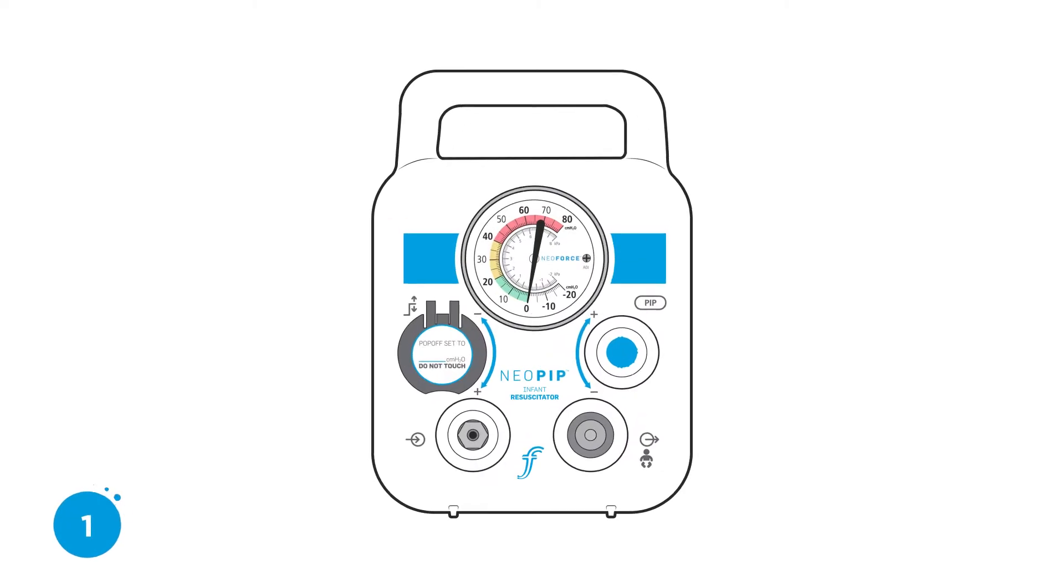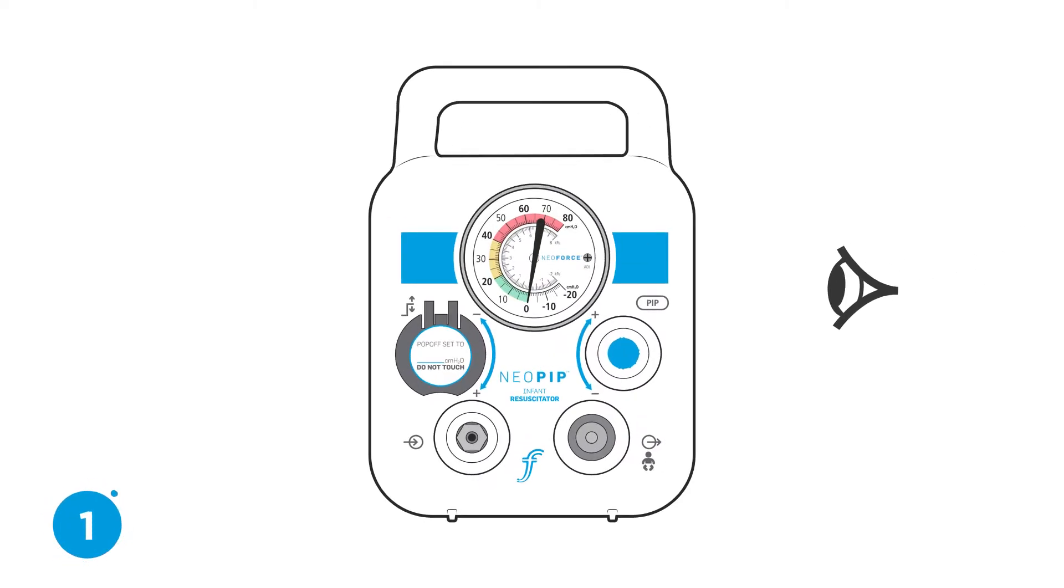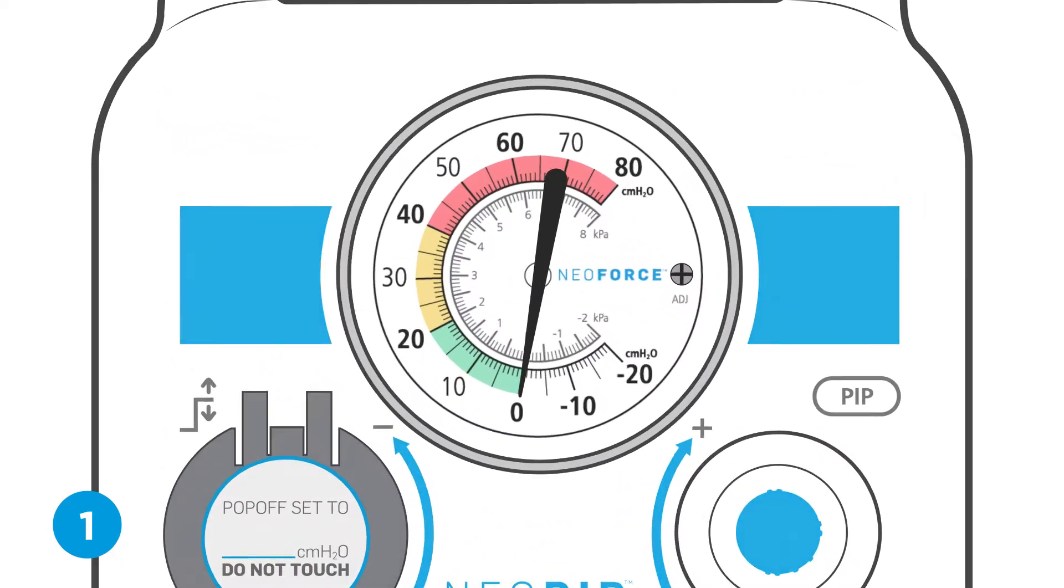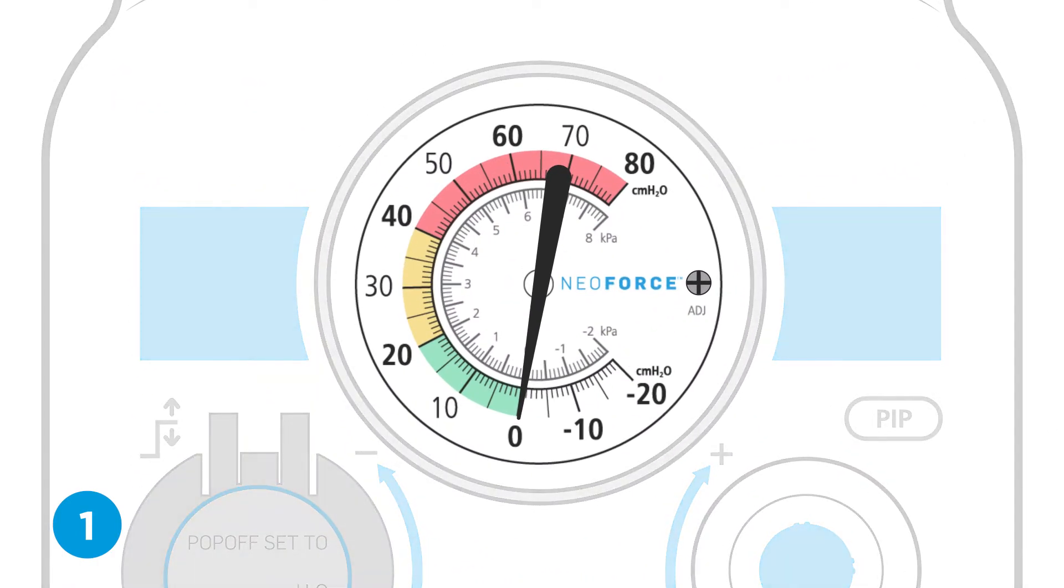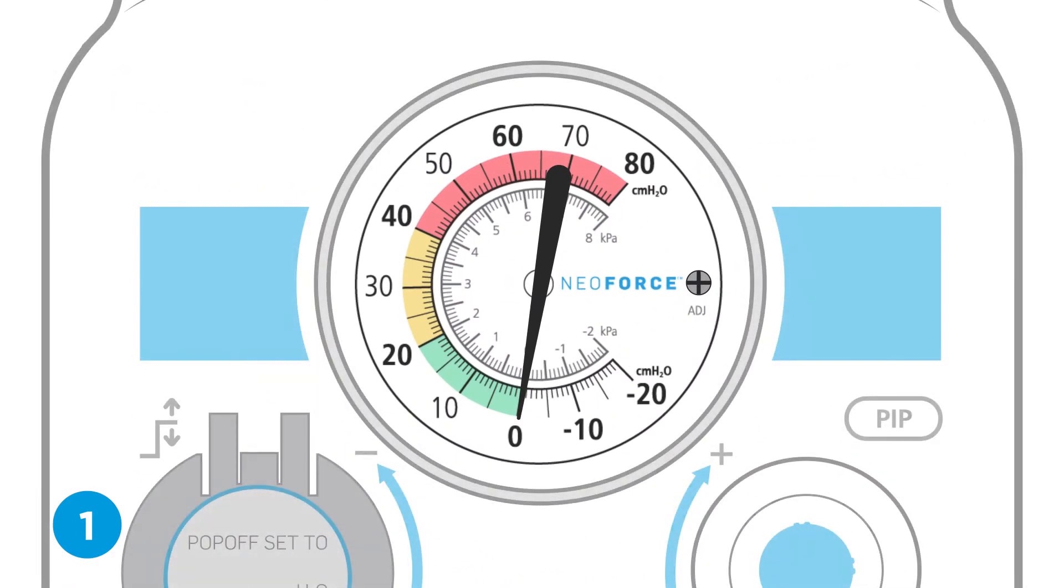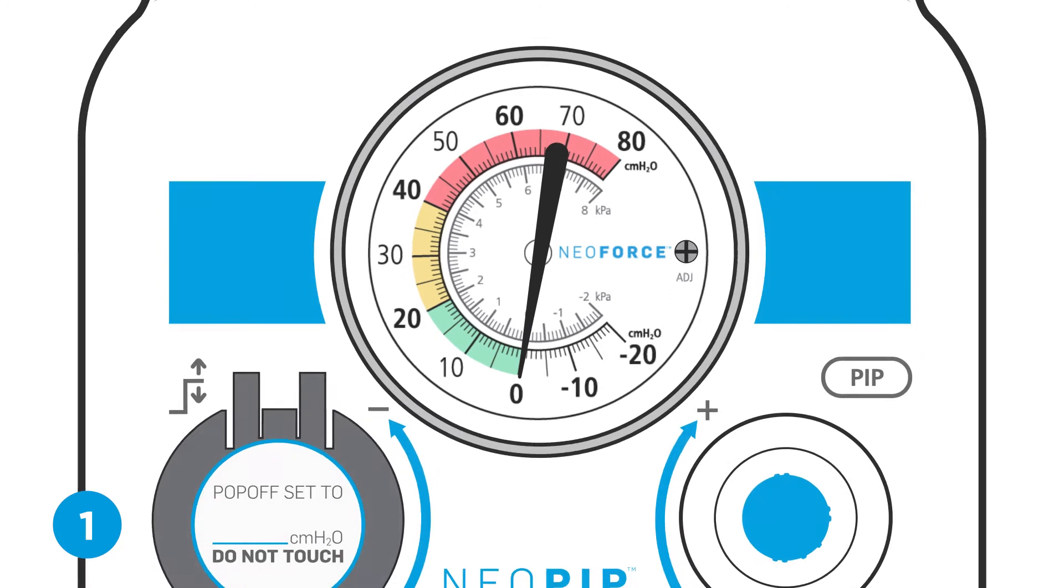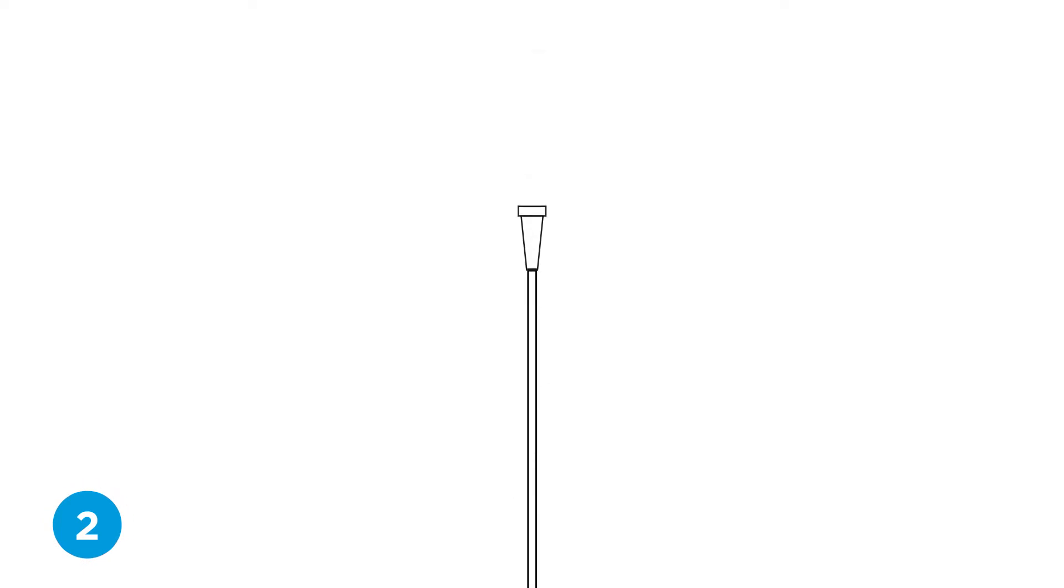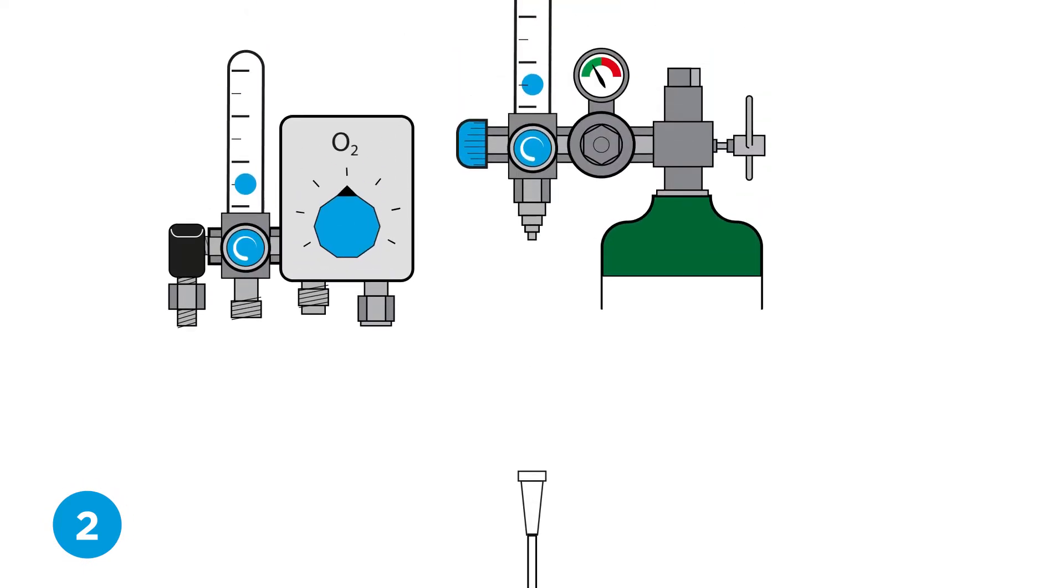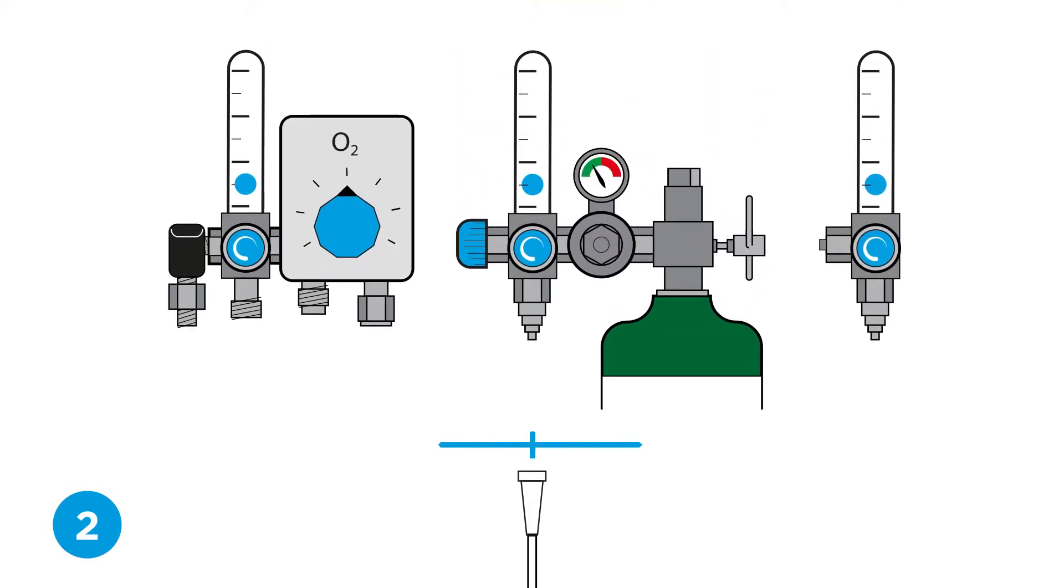Step one, check pressure gauge. Check if the pressure gauge reads zero when the unit is not connected to a gas source. If not, then follow the re-zeroing instructions. Step two, connect the gas supply. Connect the gas supply tubing to a flow meter or blender.